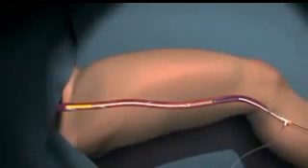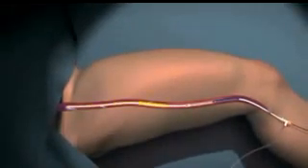An average 45 cm length vein treatment may be typically performed in 3 to 5 minutes.